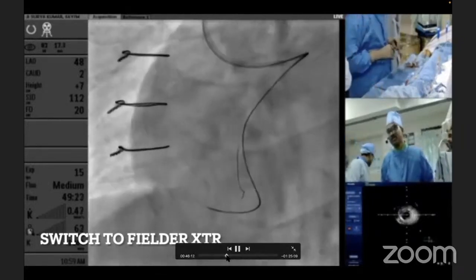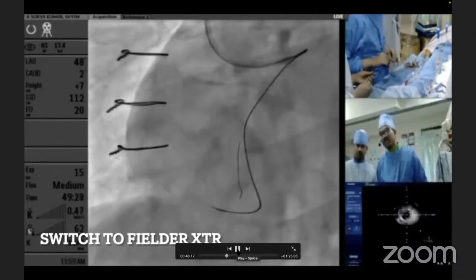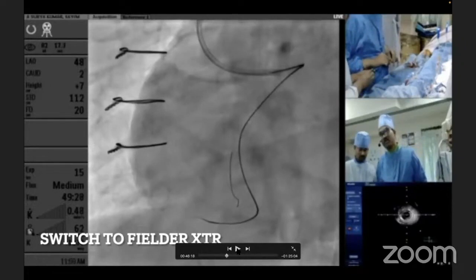So, Dr. Vijay, what would you like to say about this strategy up till now? Yeah, I think Sharath felt the septal is the safest way to go through. It looks like an extremely difficult case. It's one more CTO and a long segment proximally. We'll see how it goes. That's why it has become an investment procedure. I honestly believe it is almost like treating two difficult CTOs in one session.